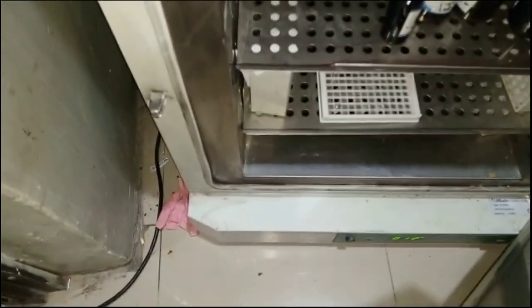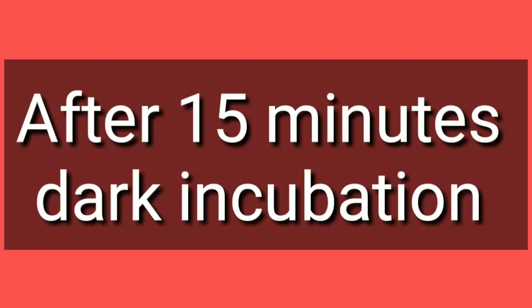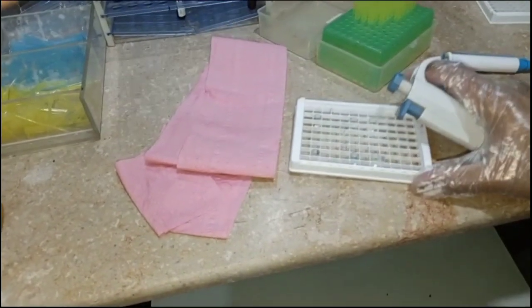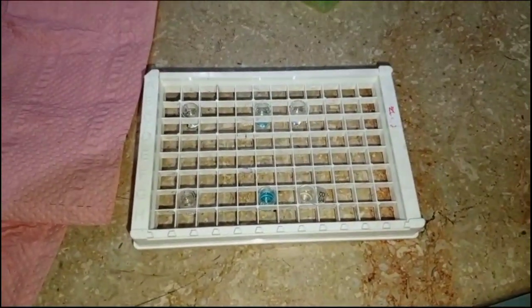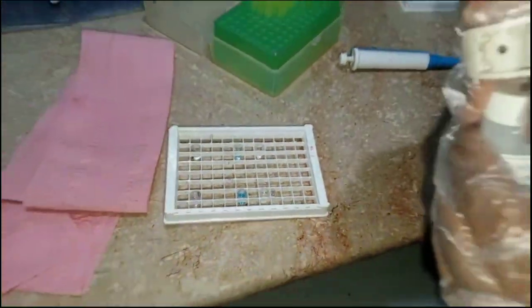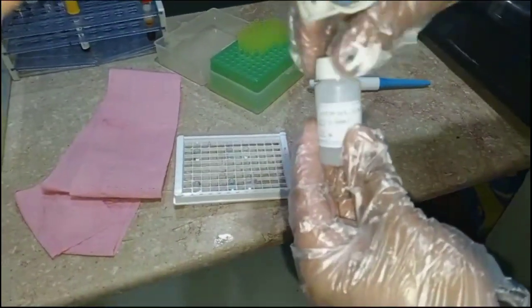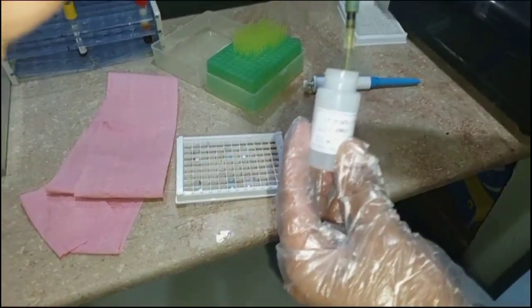So after adding color A and color B, one drop in each of the wells, we incubate it in a dark environment for almost 15 minutes. Now after the 15-minute dark incubation, what should we do? We have to take it and then we observe the color, as you can see. So in the first well of Ag and Ab, it is colorless. It means that it is negative.